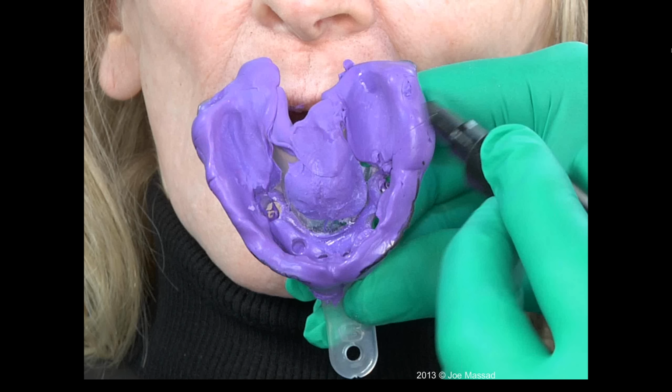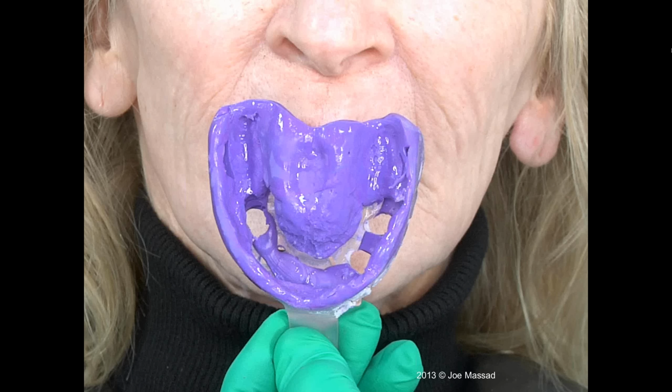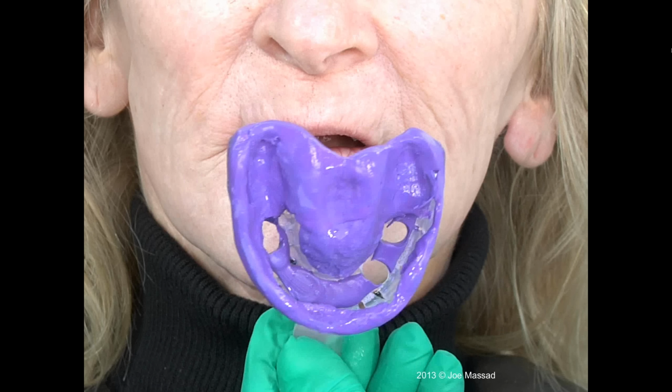The final wash will be done in a medium to light viscosity, except directly opposite the implants, I will actually inject this very extra rigid material into the tray to support the analogs at the time of pouring up the model. And you're going to see this. So I'm injecting the extra rigid directly opposite the implant copings.